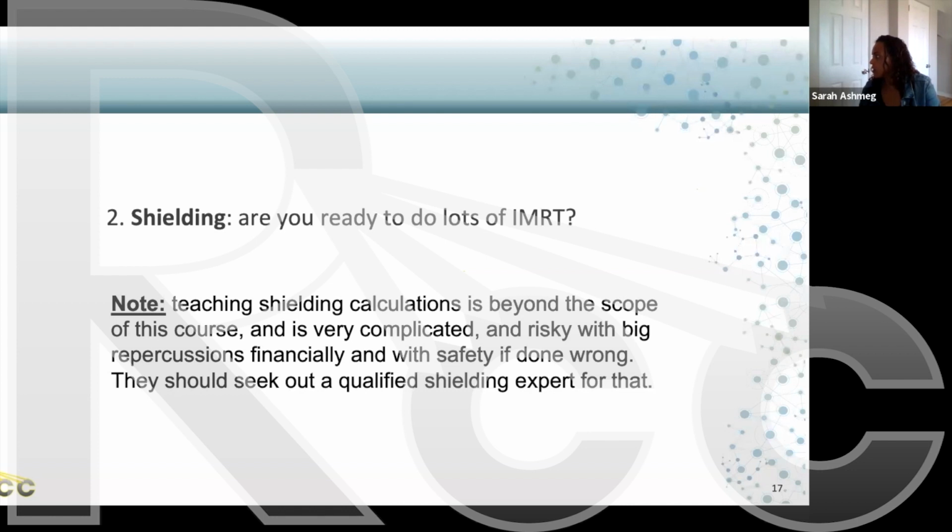The first question was, I think it's an important question. We would like you to briefly explain the difference between forward and inverse planning. Sure. Yeah. So forward planning generally means that you are physically setting the shape of your MLCs or your compensator. You're drawing them yourself because you know what the tumor looks like.